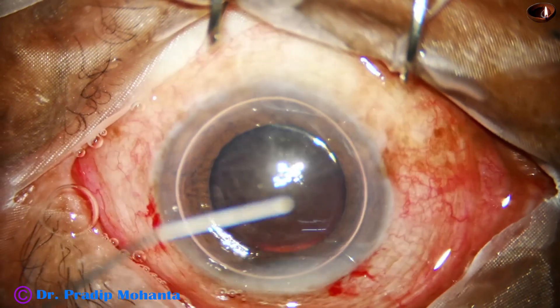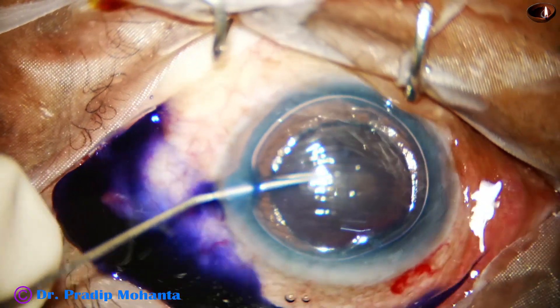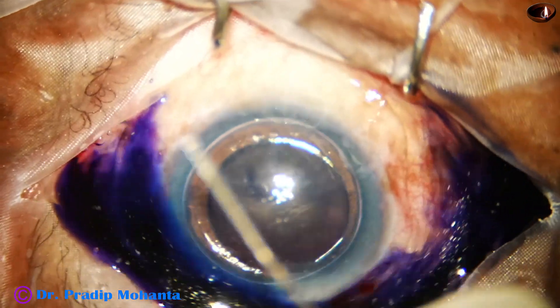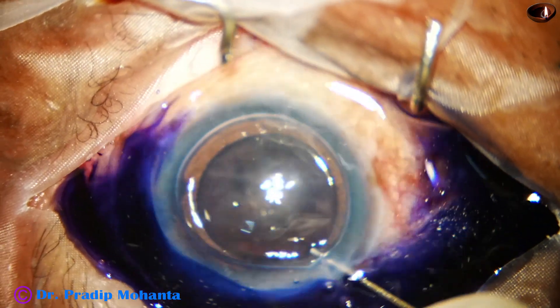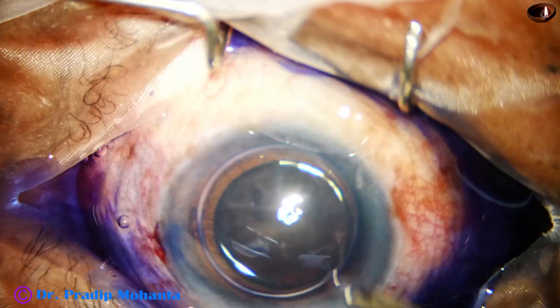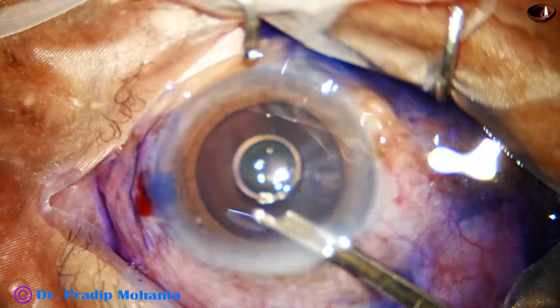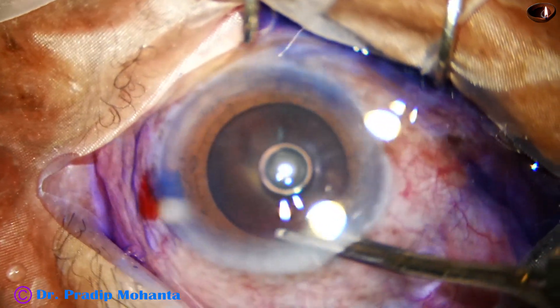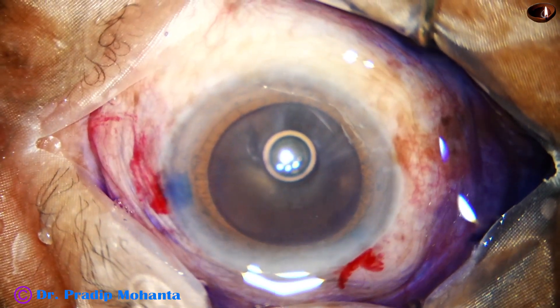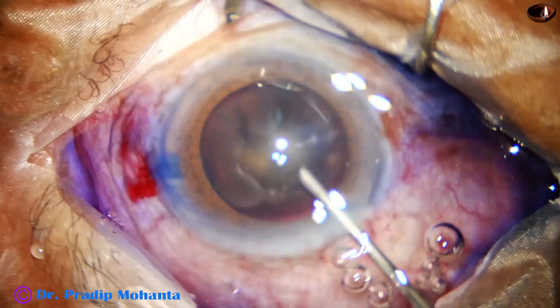Beneath this air bubble, trypan blue dye is applied over the anterior capsule, and within a very short time — maybe about 10 to 15 seconds — there is very good staining of the anterior capsule, because the dye is not diluted by aqueous. Now the dye is washed out and the anterior chamber is filled up with 2% hydroxypropyl methyl cellulose.